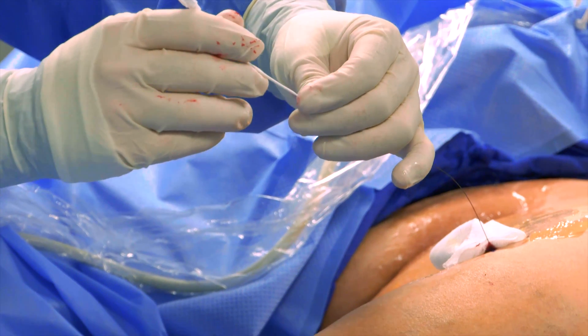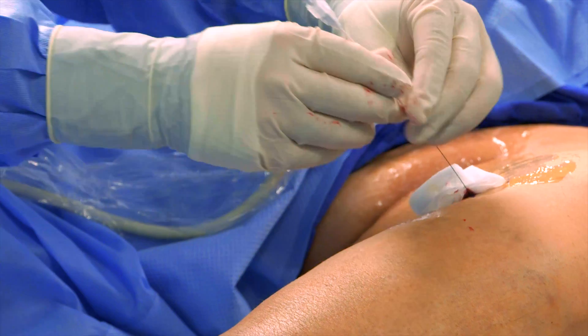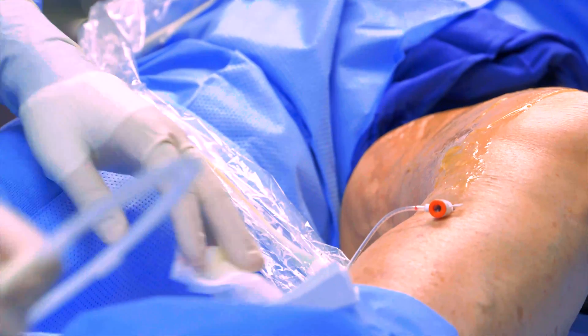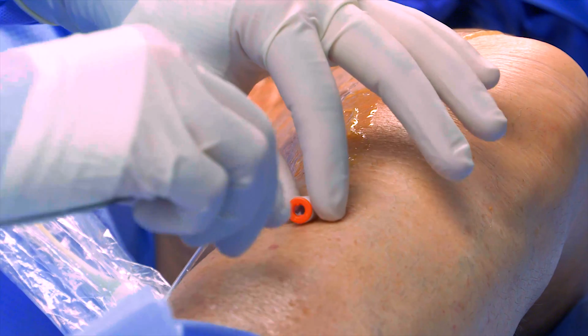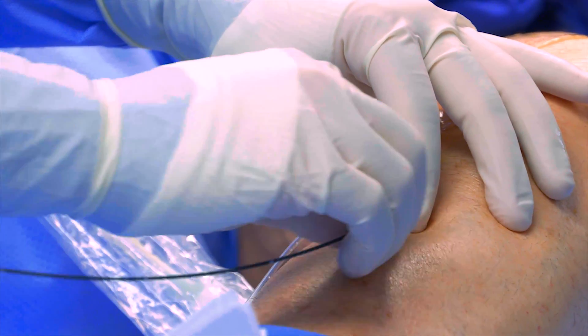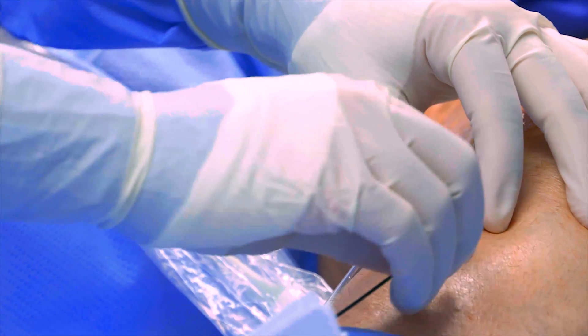A device called an introducer is then fed over the wire, which is used as a guide for the catheter. The guide wire is then removed and the radiofrequency catheter, or laser fiber, is then passed through the introducer and floated up through the vein to what is called the sapno-femoral junction.